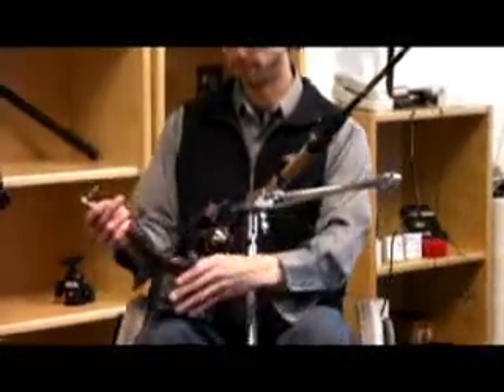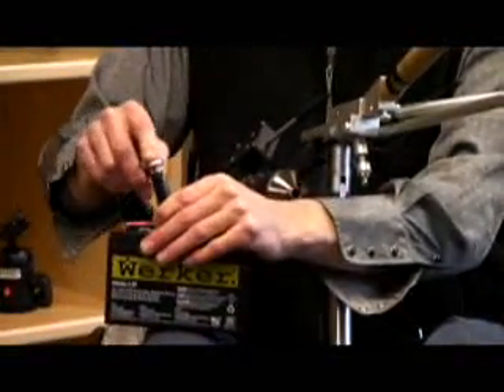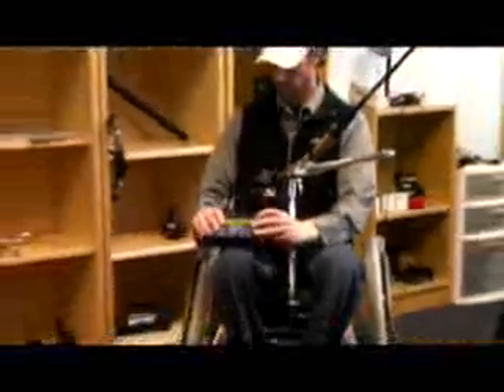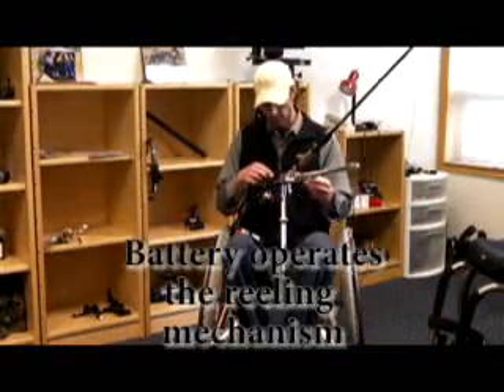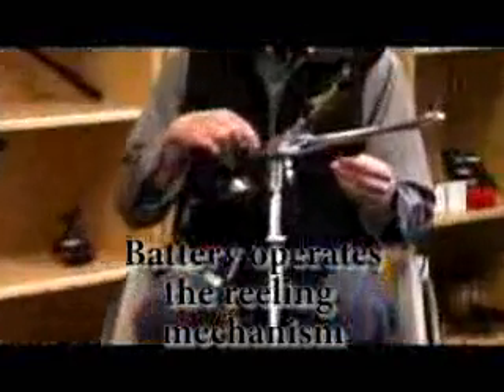Simply plug the end of the motorized motor into the battery, which will operate the reeling mechanism by this toggle here.